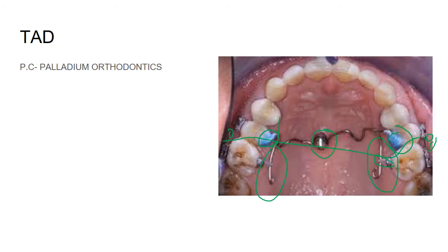Multiple modifications can be made to the TPA. One modification has an additional welded distal unit on both sides attached to lingual buttons on the maxillary molar to exert intrusive force. To achieve true intrusion without palatal tipping, you need force from both the palatal and the buccal side simultaneously — so implants on both the buccal left and right are required in addition to the palatal force.